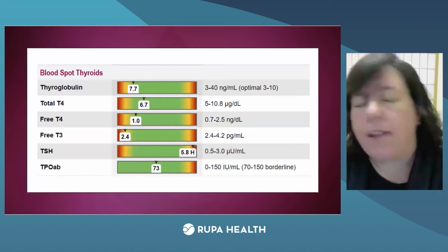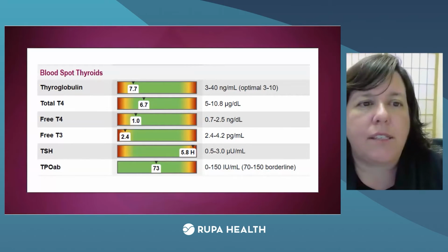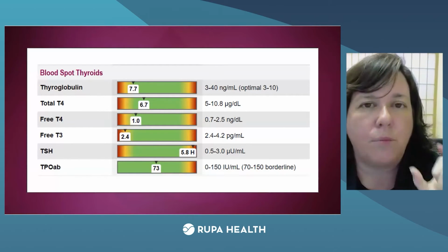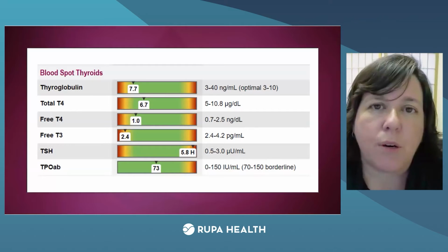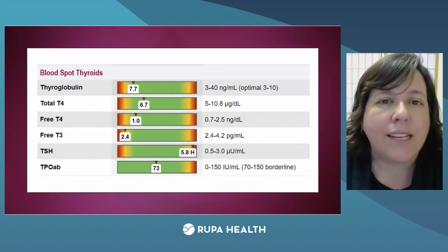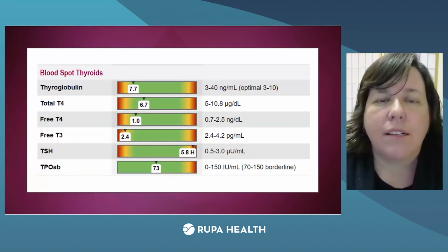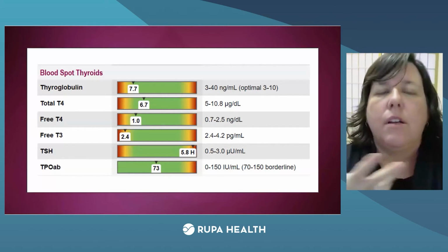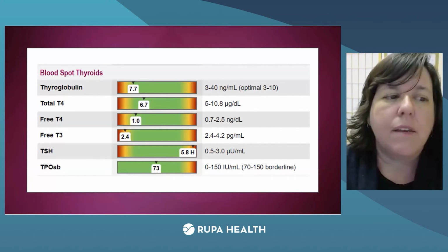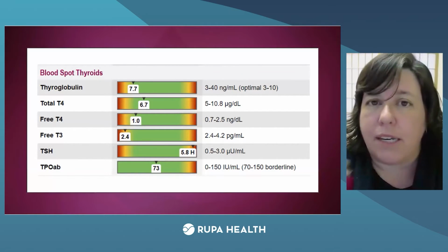All right, so this is what ZRT, we'll just do a little orientation here for people who are not used to seeing it. So we have the sliders, the results are within the sliders, and then you can see the ranges to the right as well. Most of these, like I said, are actually laboratory standards, national standard, except TPO antibodies. Those are not nationally standardized. The way these work is we buy a kit from a manufacturer that we use to process those labs. There are about 4 different kit manufacturers for thyroid peroxidase antibodies.